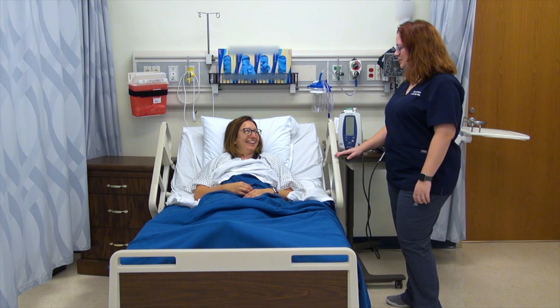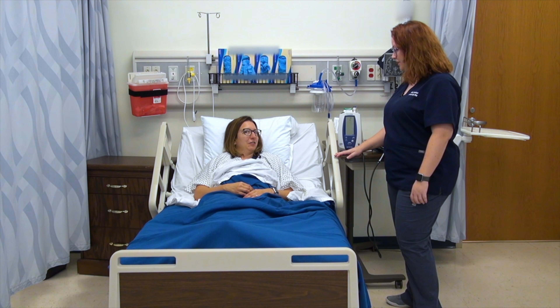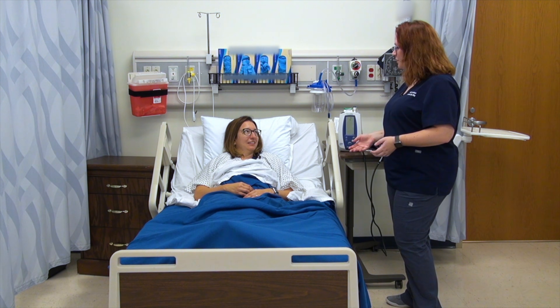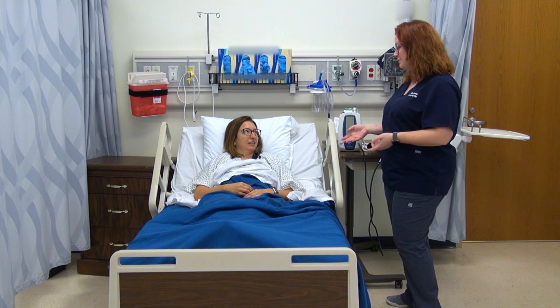Hi Miss Kathy. So your doctor has ordered for us to do some orthostatic blood pressure checks on you. I understand that you've been feeling a little bit dizzy when you stand up or a little bit weak, so we're just going to check to see if your blood pressure is changing when you change positions.